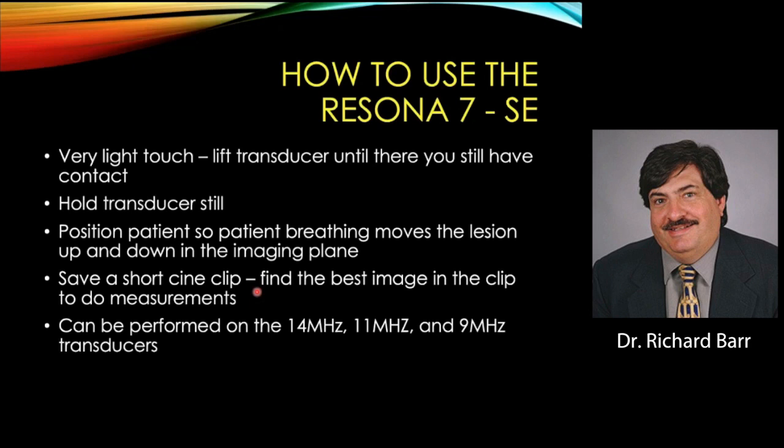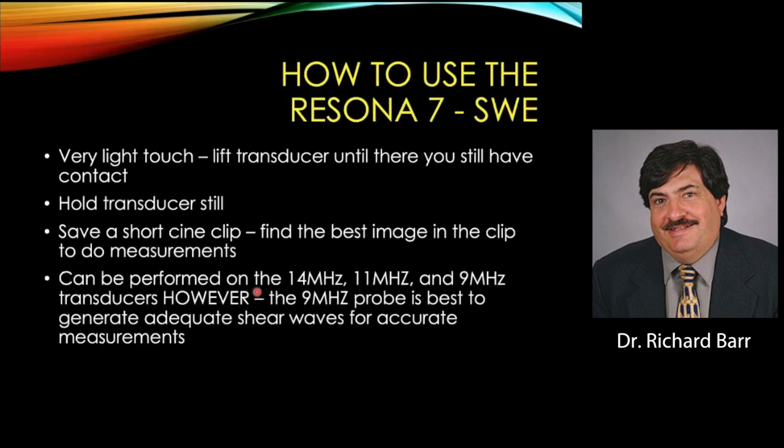You can save a short cine clip and then find the best image to do your measurements. And you can perform this on the 14, the 11, and the 9 megahertz transducers. For shear wave, again, the technique is exactly the same. You light touch, hold the transducer still, position the patient the same way, take a short cine clip, and do your measurements. And again, you can just push the buttons, keep your probe in the same place, and push strain and shear wave, and you can do both without moving the transducer.